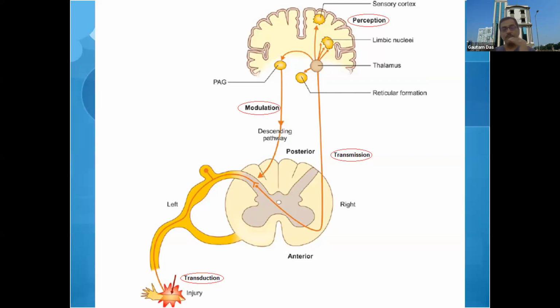In the majority of nerve stimulators, you cannot change the frequency too much, but in radio frequency machines we can change this frequency. If you increase the frequency to a range of 20 to 40 Hertz, then you will be able to stimulate the touch fibers.